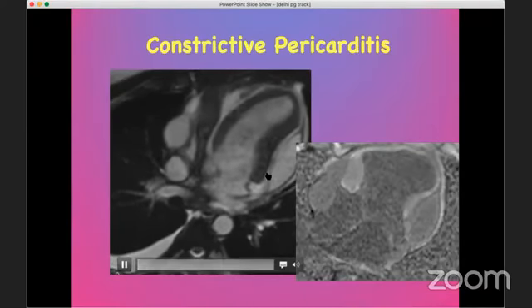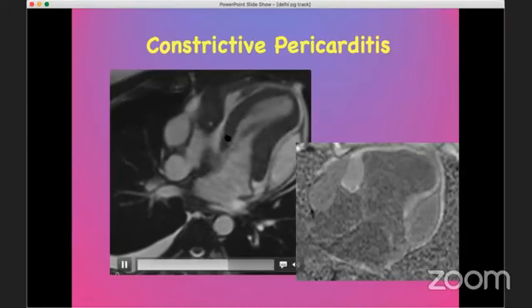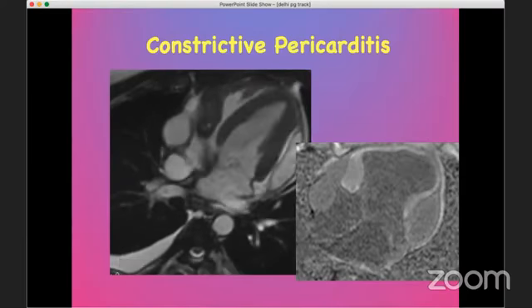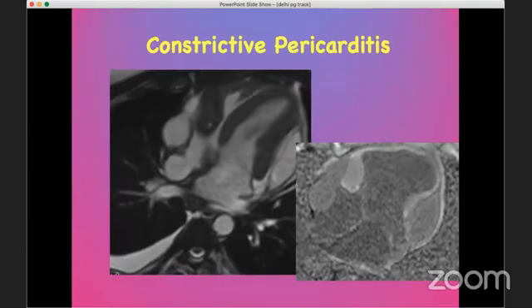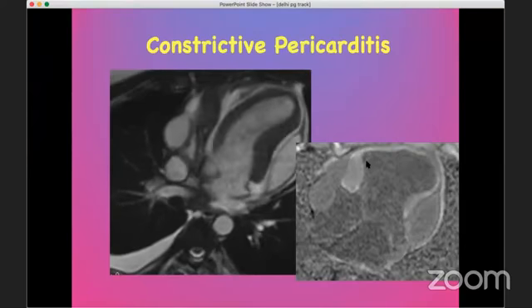We call them laterally challenged ventricles. And this is a classic example of ventricular interdependence. And what is the additional role for MR is that although it shows the physiology very well, I'm sure this can be also acquired with good quality 2D. But in addition, after gadolinium, it gives us important information.